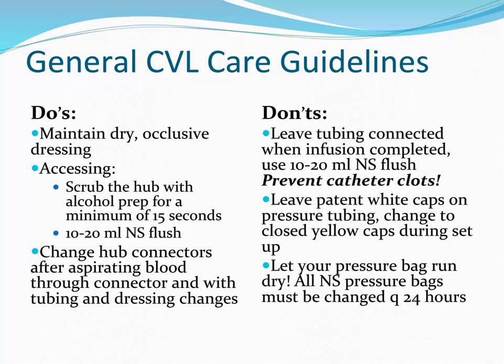Here are some general guidelines for CVL care. Following these guidelines is a critical part of preventing CLABSI and mitigating iatrogenic complications of line placement. So the must-dos include: maintain a clean occlusive dressing, removing the Curos caps or scrubbing the hub for a minimum of 15 seconds before accessing the catheter, changing hub connectors every 96 hours or when blood has been aspirated through the connector, and with all CVL dressing changes and tubing changes.